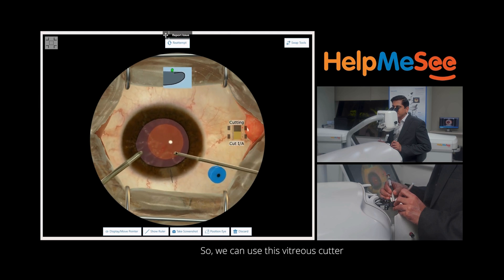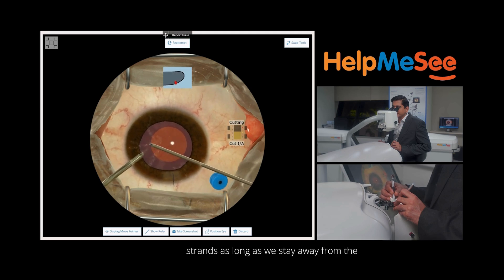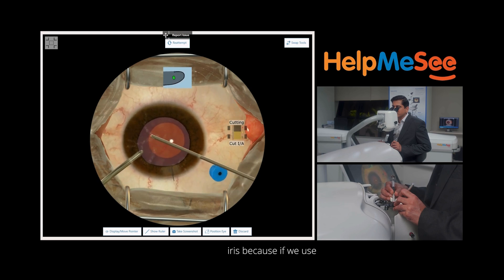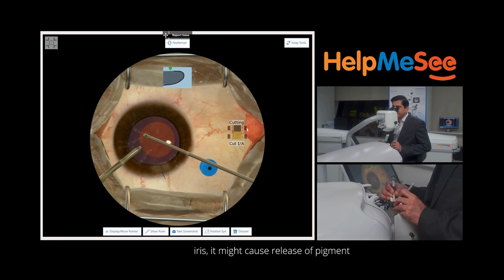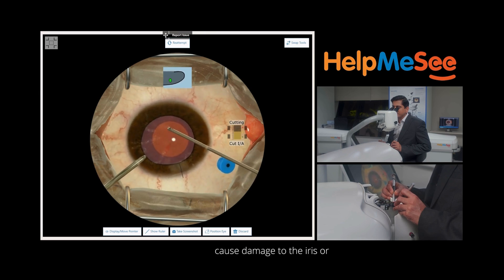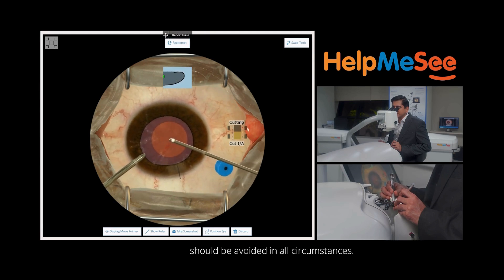We can use this vitreous cutter efficiently closer in the bag to remove all the vitreous strands as long as we stay away from the iris. If we use the cutter closer to the iris it might cause release of pigment, or it can even cause damage to the iris or create a hole within the iris which should be avoided in all circumstances.